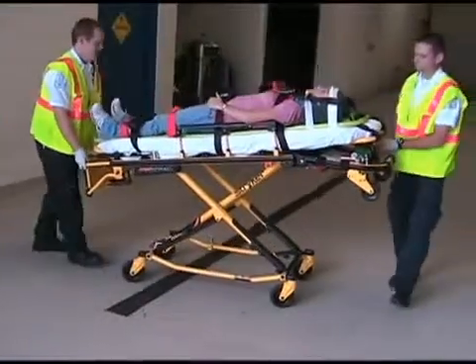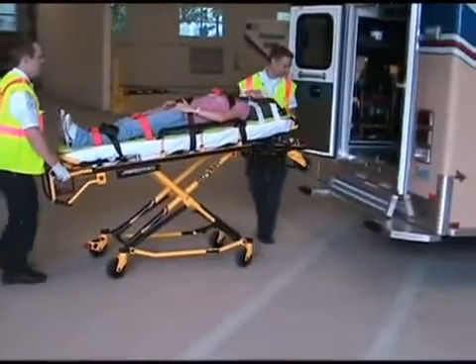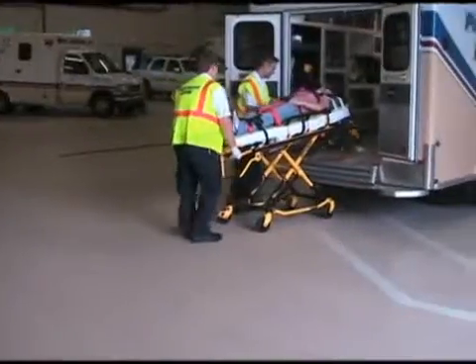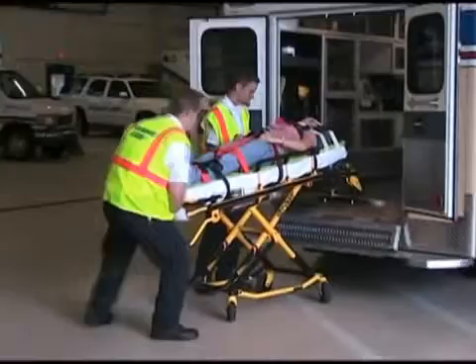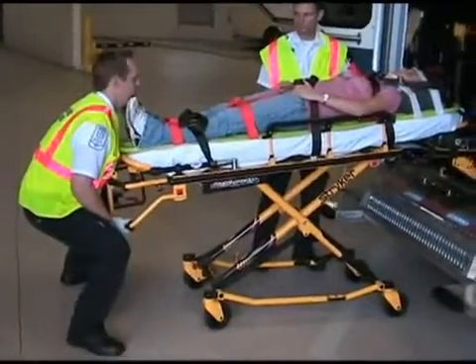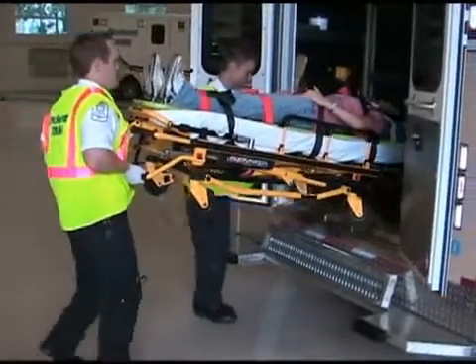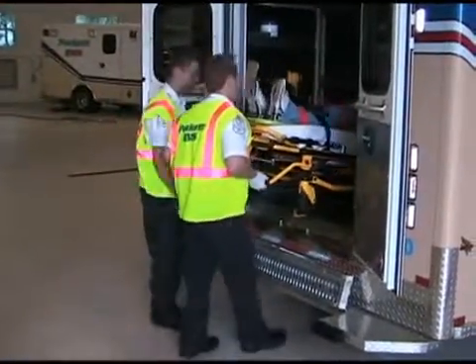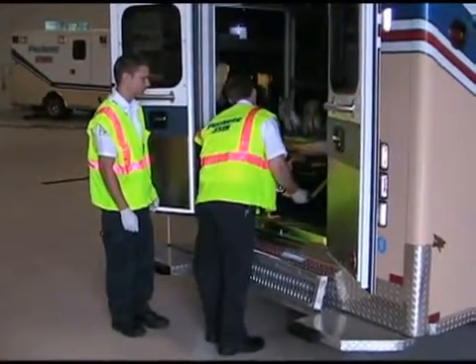Push the stretcher forward until the loading wheels are on the patient compartment floor and the safety bar passes the safety hook. This should be verified through visualization and communication. Operator 1 should grasp the stretcher frame at the foot end using the upper or lower handles. Lift the foot end of the stretcher until the weight is off of the latching mechanism. Squeeze and hold the release handle.